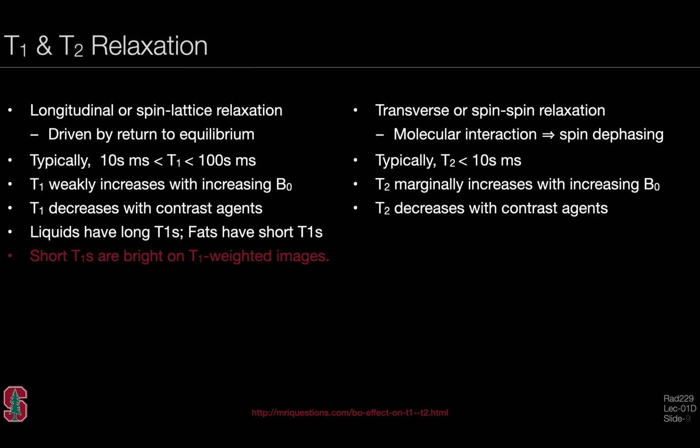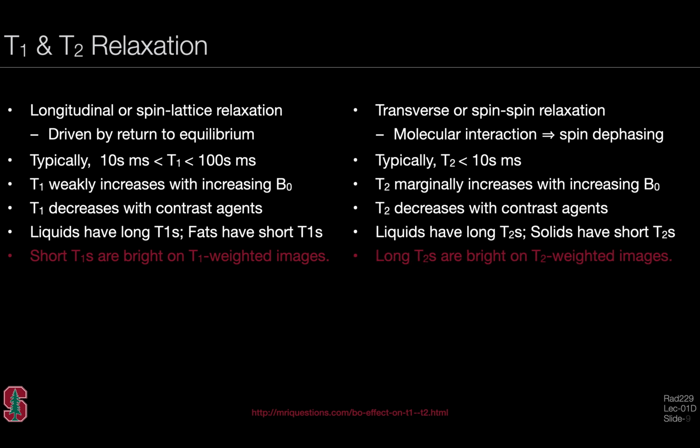T2 can also be decreased with contrast agents, although the effects on image contrast will be quite different between T1 contrast agents and T2 contrast agents. Liquids in particular have long T2s, and solids have especially short T2s. And it's good to remember that long T2s are bright on T2 weighted images. Lastly, T2 is always less than T1, and this is helpful for remembering values associated with these time constants and a good principle to keep in mind.